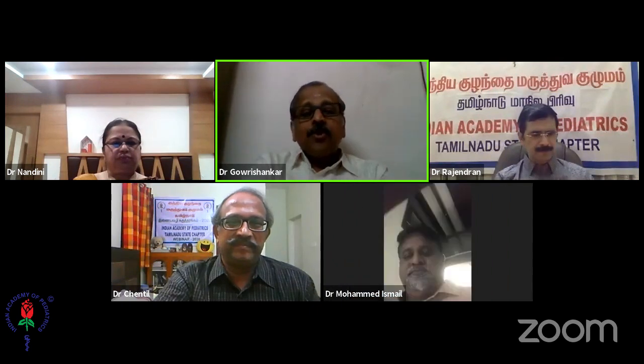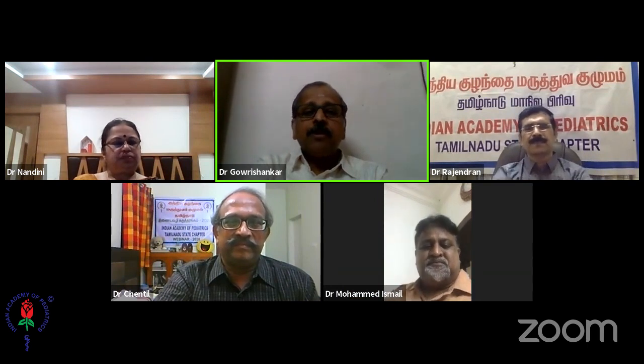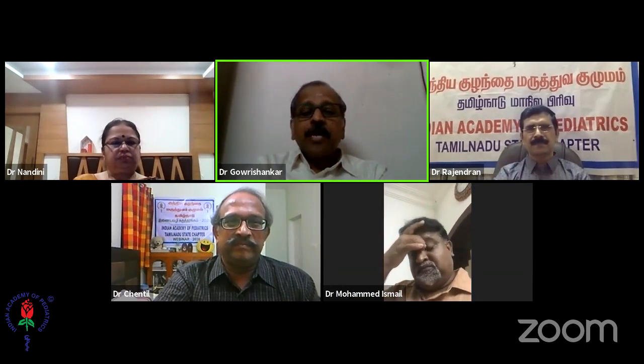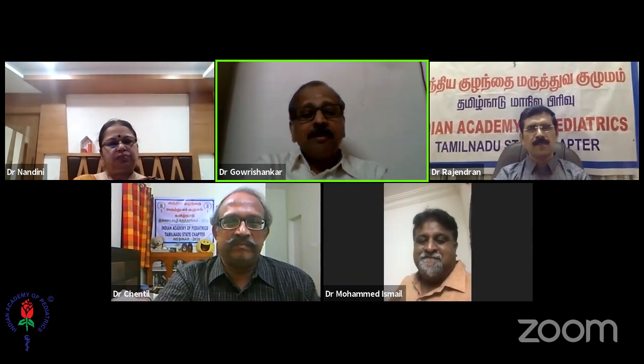Previously, we were doing fluoroscopy in ICH, which will show the pendular movement of the heart. But nowadays we don't do fluoroscopy, just these two, but whenever there is a doubt, you go in for a flexible scopy. And most of the pediatricians are able to make out by noting a decrease in the air entry in this hemithorax. So clinically, most pediatricians are able to pick it out, and the X-ray also gives them an added clue that this child has a suspected foreign body. The sound also helps them.